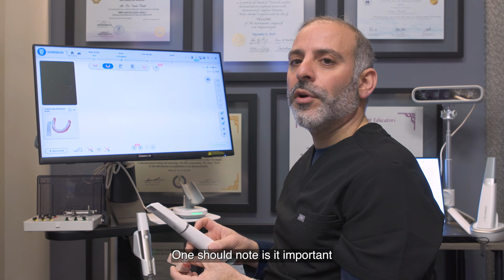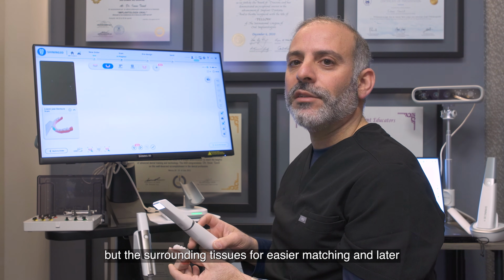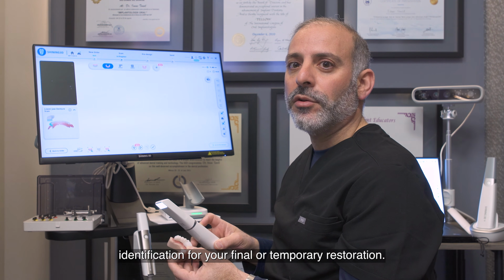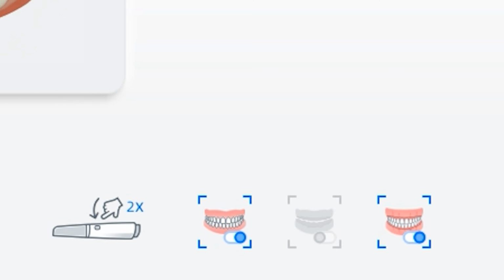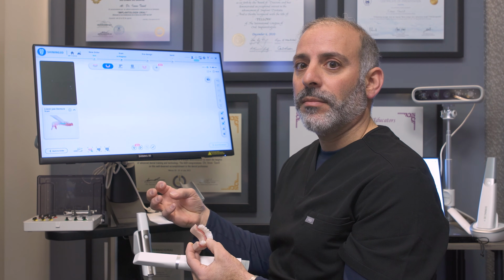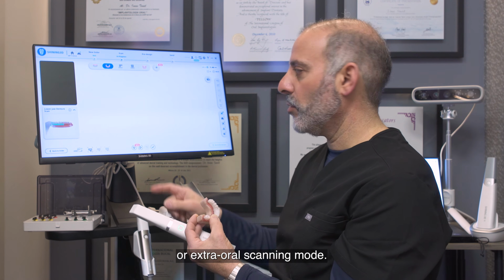One should note it is important to capture not only the existing teeth or denture, but the surrounding tissues for easier matching and later identification for your final or temporary restoration. When scanning intraorally, it is important that the AOX feature is engaged for better scanning in the intraoral scanning environment. However, we are using a model here, so we will pick model scanning or extraoral scanning mode.